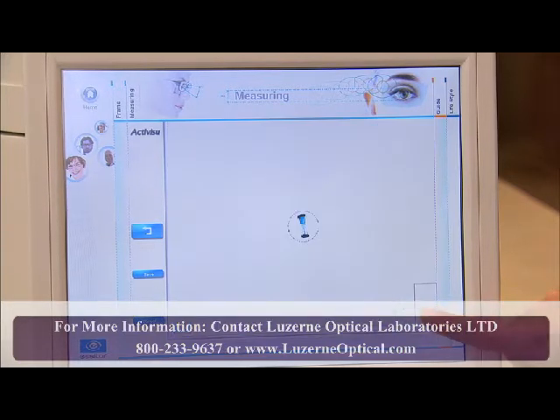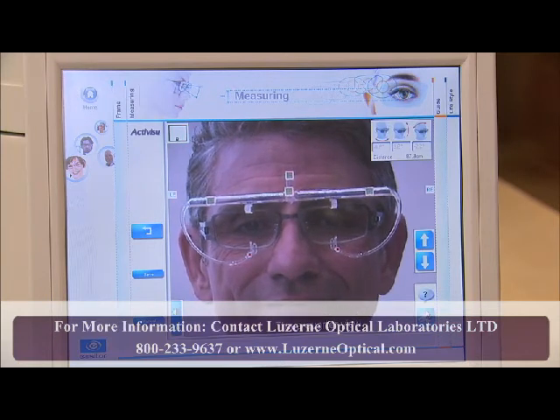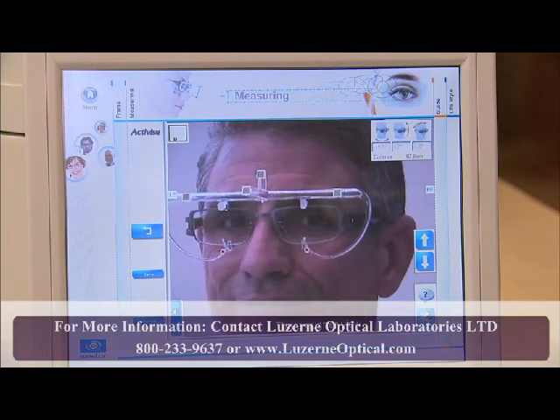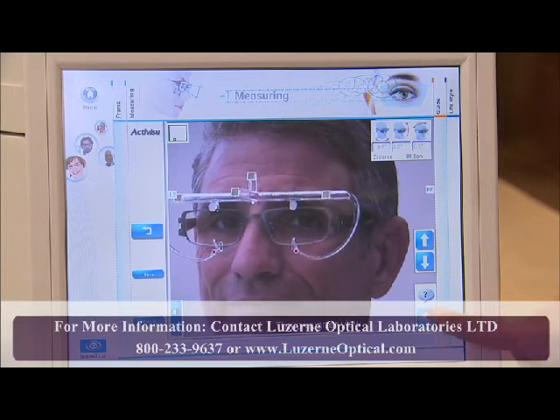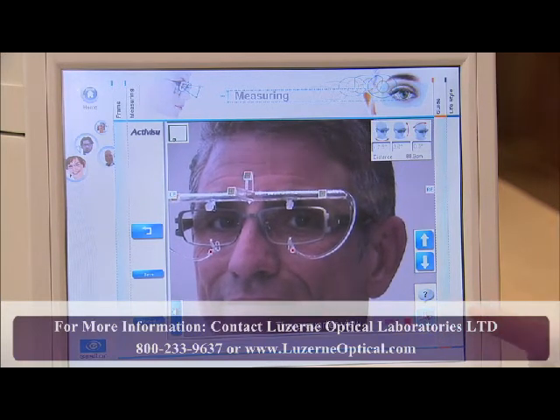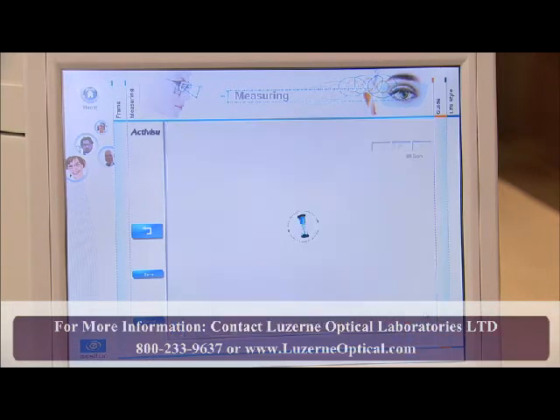While keeping the eyes focused on the mirror, have the patient turn his or her head roughly 20 degrees in one direction. Again, click on the video camera icon to start the measurement. The software will select the best image. After reviewing, click OK.